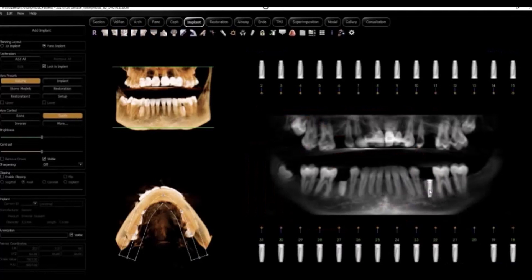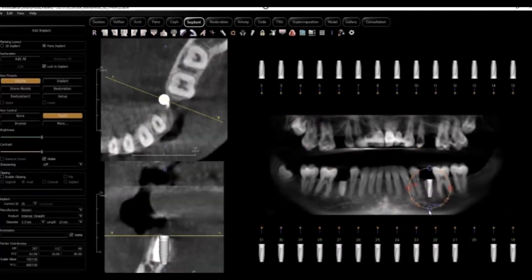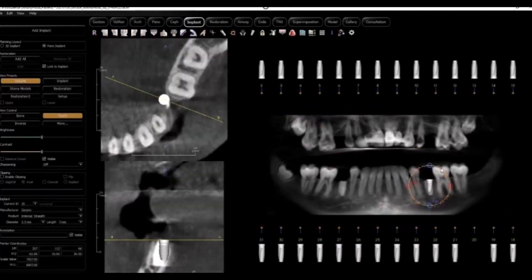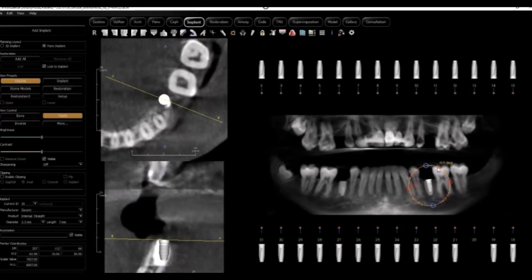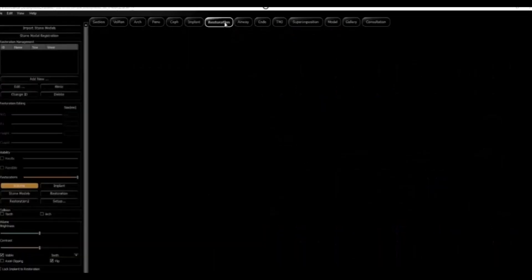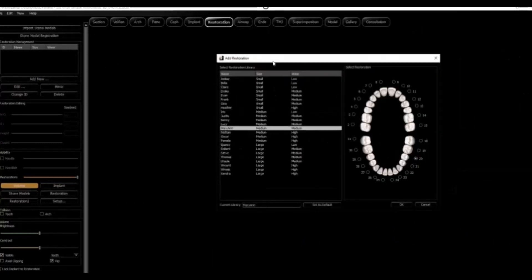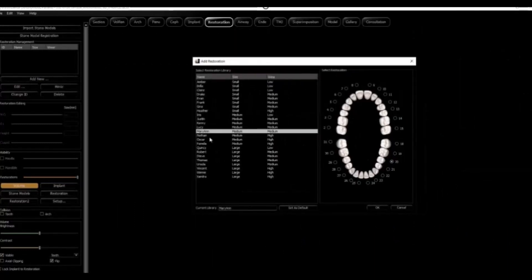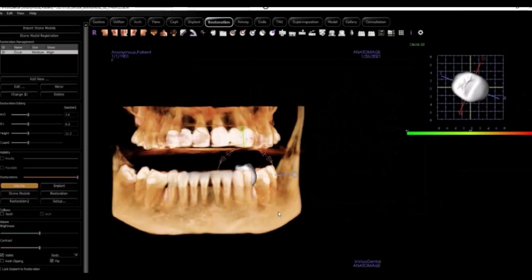First, drop in and position your implant. Now you have a tooth library that will populate and you have to select from that library the type of crown that would best fit the patient's existing anatomy. Then you make adjustments from there to make the tooth fit in with the patient's bite and dentition.